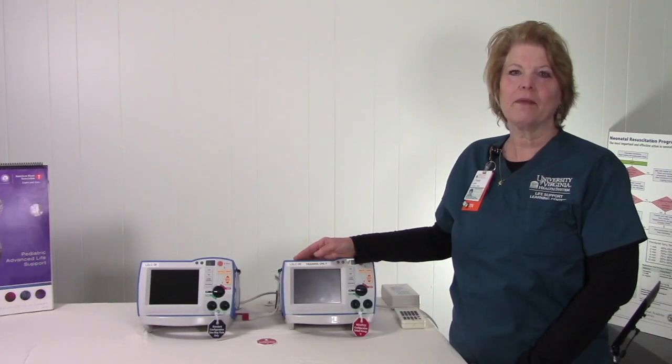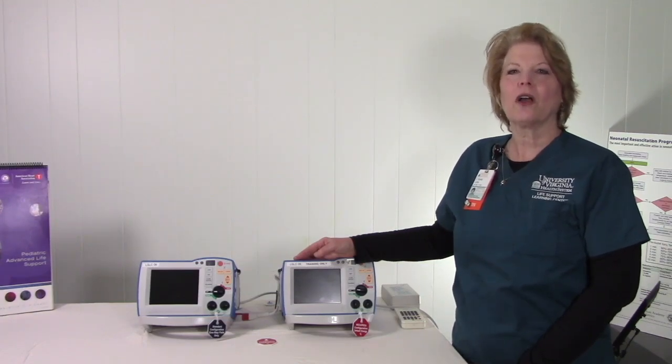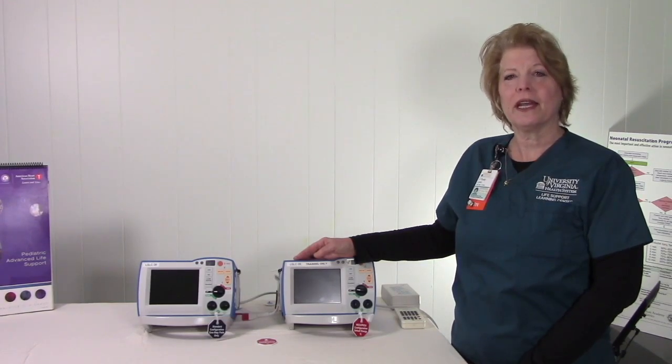Hello, my name is Dusty Lynn and I'm the Pediatric Educator at the Life Support Learning Center. Today we're going to talk about the Zoll R-Series and its use in the neonatal ICU.